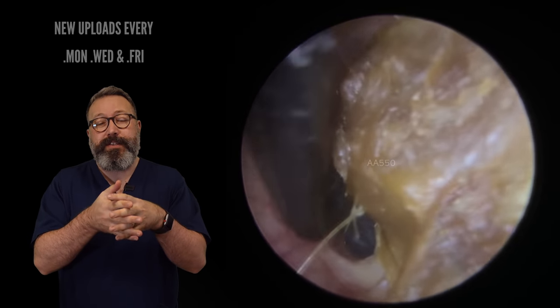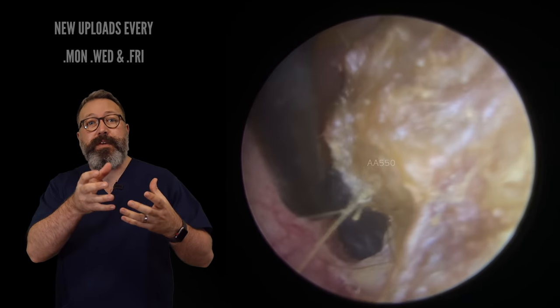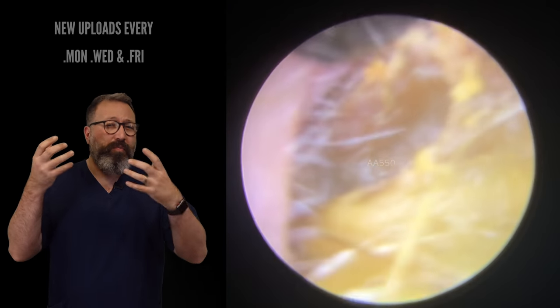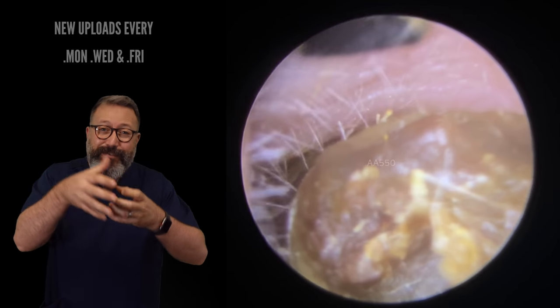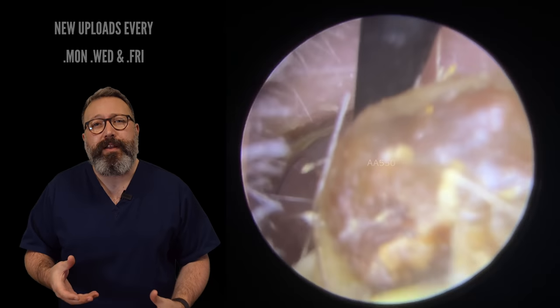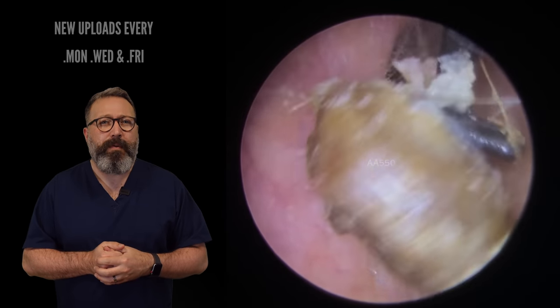We've got this lovely gap down the one side here. This patient wasn't really complaining of hearing issues because we've got this nice big gap, but more of a sensation in the ear. When they had a bath or a shower and got any water in their ears, it was feeling really blocked up. That's because the water is getting down the side of this piece of wax and not able to evaporate out very quickly. So the patient was feeling blocked for a good few hours after having a bath or a shower.